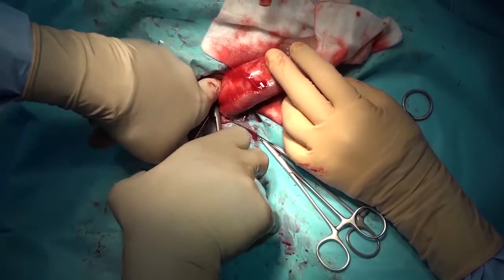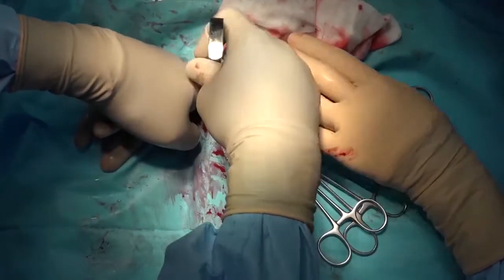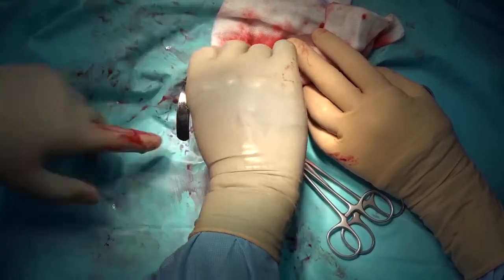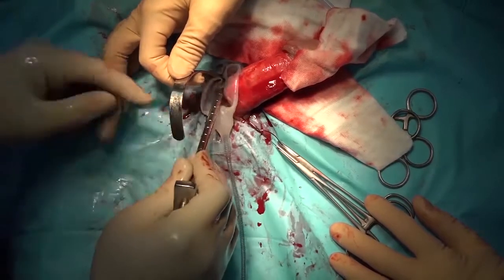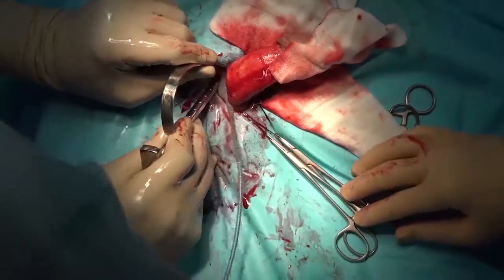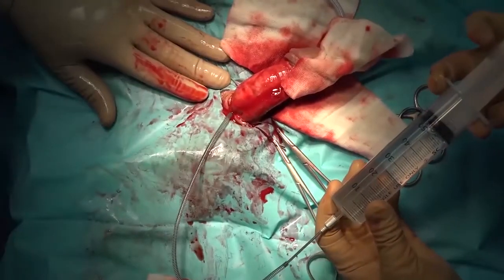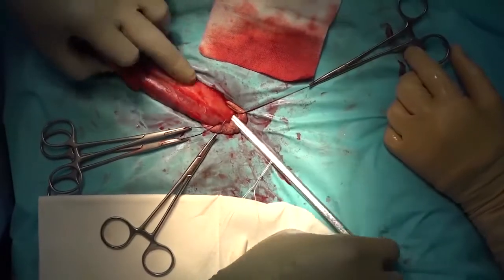A Kelly clamp was used to make the space, and the cylinder was placed.